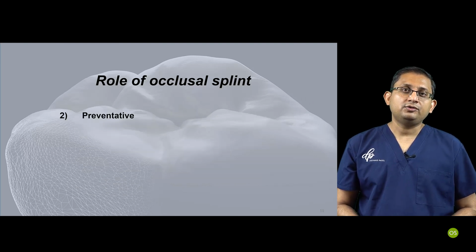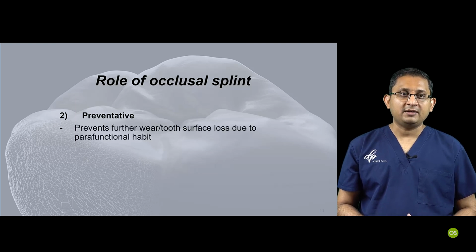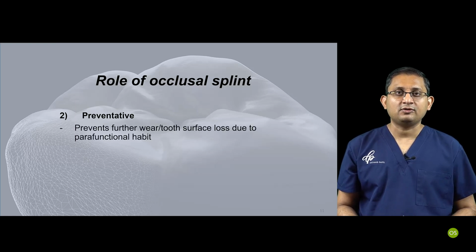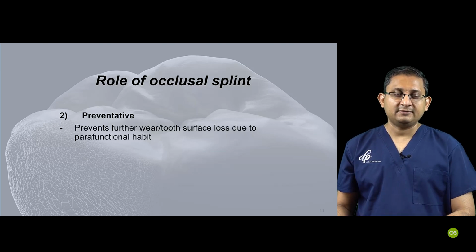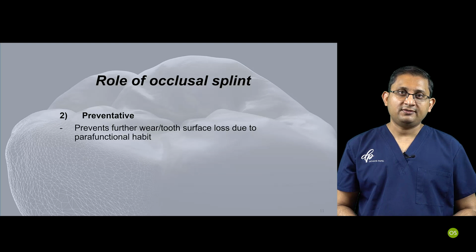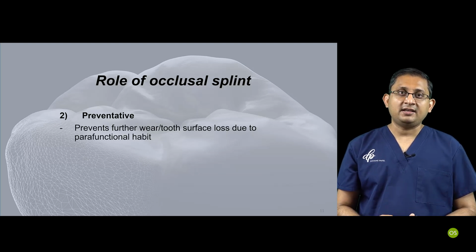So the other use is preventative. This is something we know very well, that it prevents further wear and tooth surface loss, which is happening because of the grinding, clenching, or bruxing. It doesn't prevent the tooth surface loss due to daily activity, acid erosion.